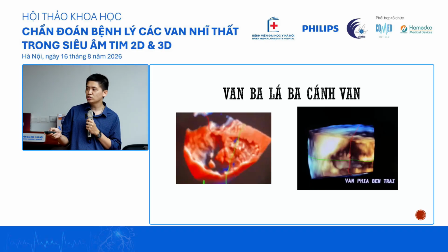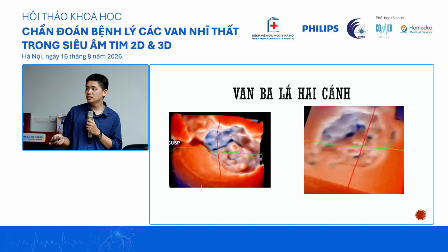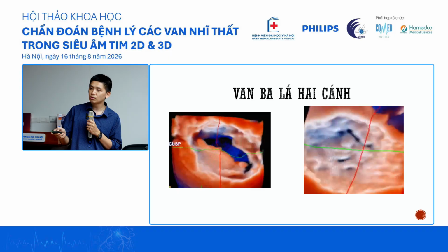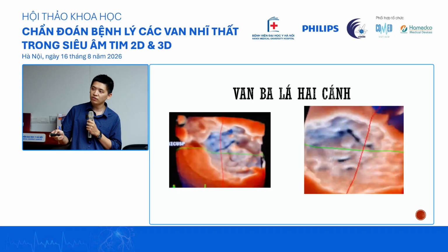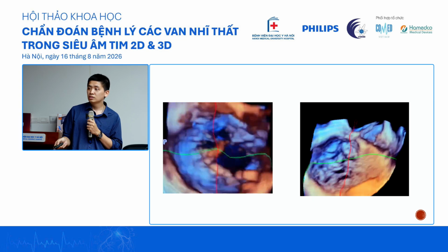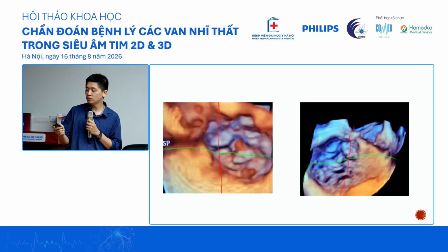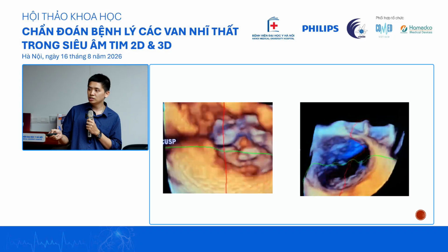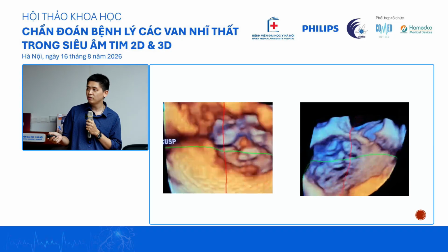Sometimes in patients with congenital heart disease, it could be useful in identifying what valve you are looking at, as this one is a patient with transposition of the great arteries. So this is a patient with a bicuspid tricuspid valve. You can see there's a raphe here, 2 valve leaflets fused and functioning as only 1 valve. This is a patient who has ASD. So you can see that it's working as a bicuspid valve.